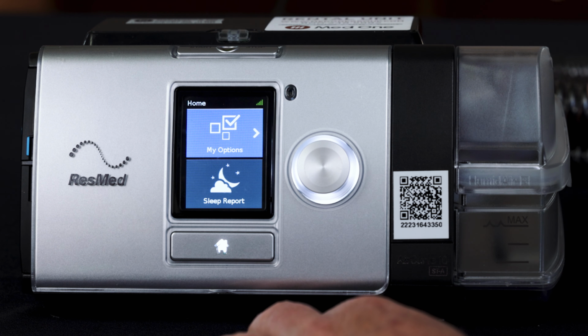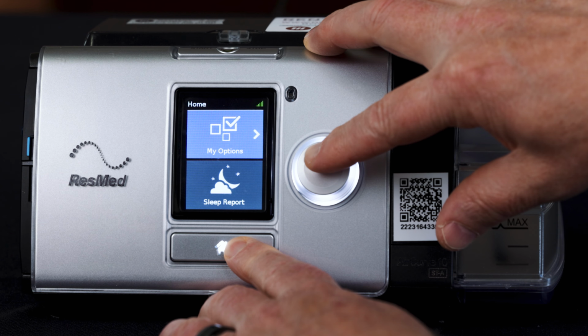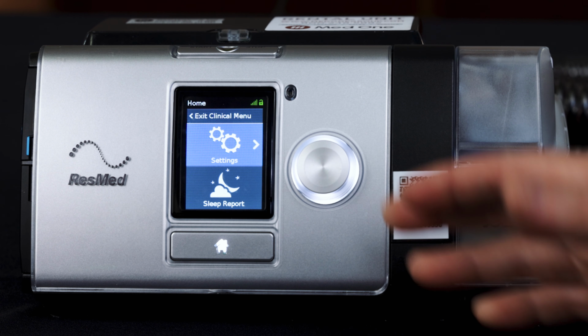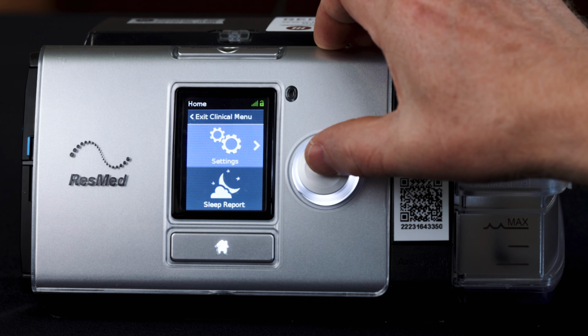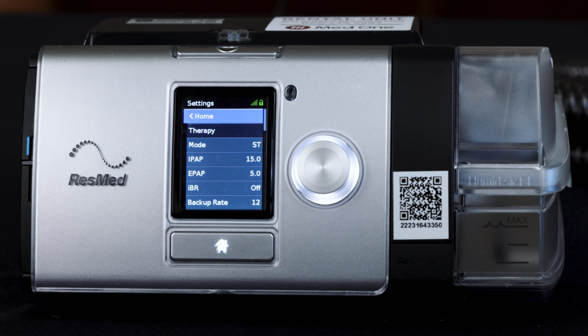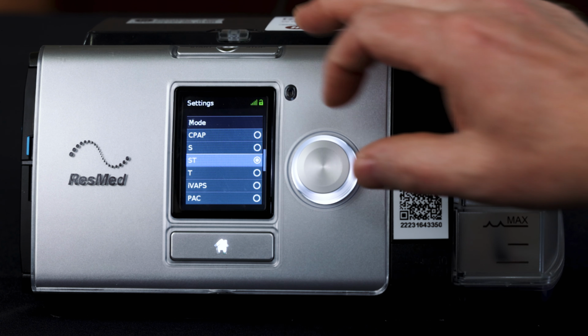Now I'm going to show you how to get into the clinical setup menu. You hold the home button and the confirmation knob up to 3 seconds. Now you're in the clinical menu. To get into the settings, you push the confirmation knob on settings. Now you have up to 6 different modes to choose from.